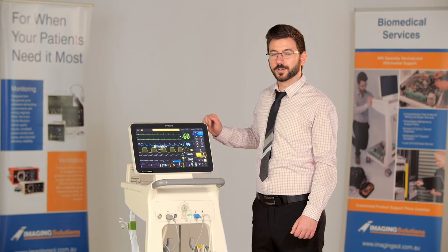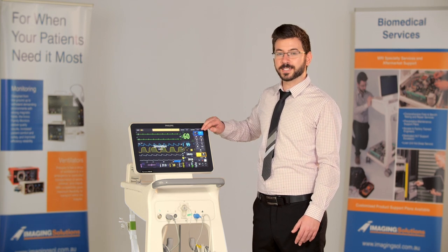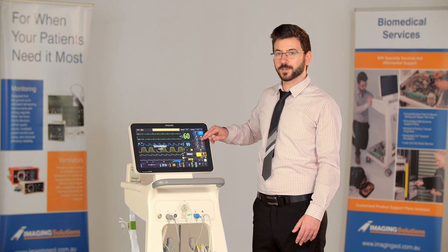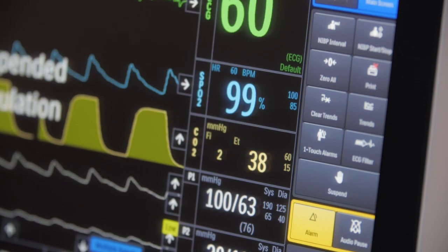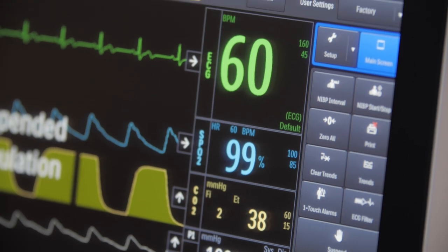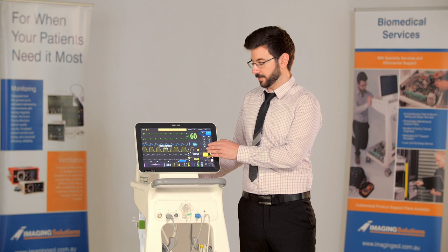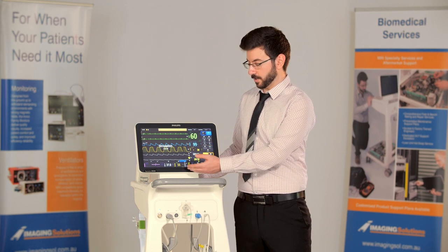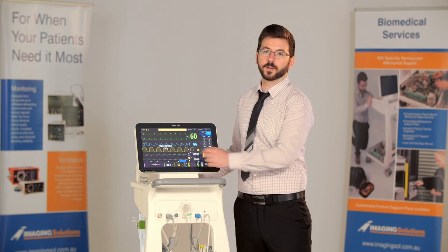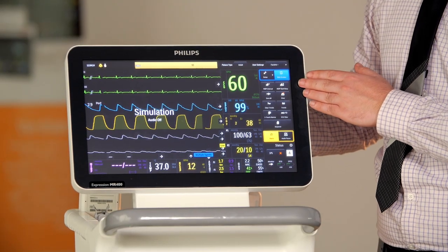The MR400 is capable of measuring several waveforms: two ECG waveforms, a plethysmograph, a capnograph and hemodynamic monitoring. The vital boxes can all be found on the right hand side of the monitor. We have the ECG, SpO2, CO2, two invasive blood pressures, all of your gases along the bottom, and then temperature and non-invasive blood pressure. All of the quick function buttons can also be found on the right hand side of the monitor.